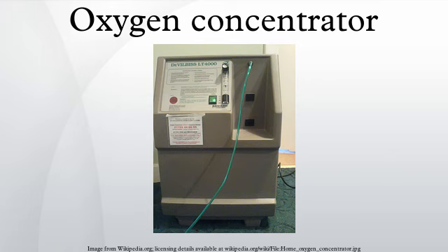Industrial oxygen concentrators are often available in a much wider range of capacities than medical concentrators. Industrial oxygen concentrators are sometimes referred to as oxygen generators within the oxygen and ozone industries to distinguish them from medical oxygen concentrators. The distinction is used in an attempt to clarify that industrial oxygen concentrators are not medical devices approved by the Food and Drug Administration and they are not suitable for use as bedside medical concentrators.